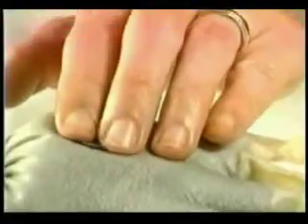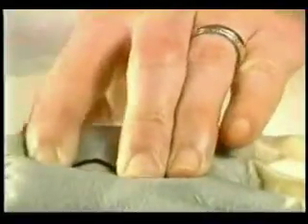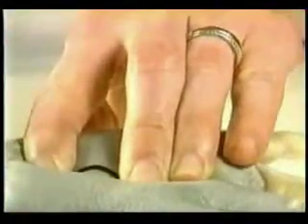Often, it helps to initially place the fingers together on top of the mass and then stretch the skin by spreading the fingers. Specific pointers for how to immobilize and approach difficult and unusual targets will follow in a special section.